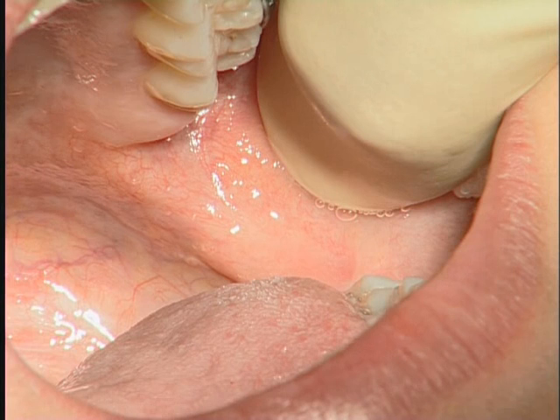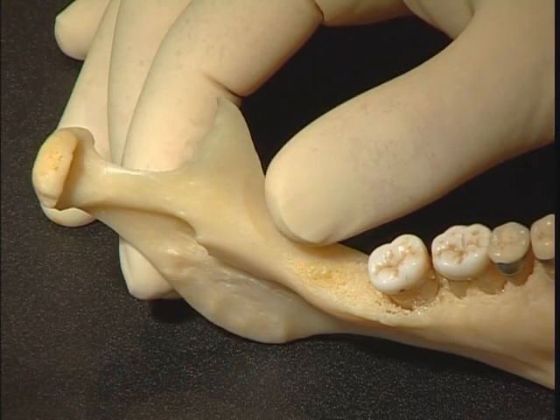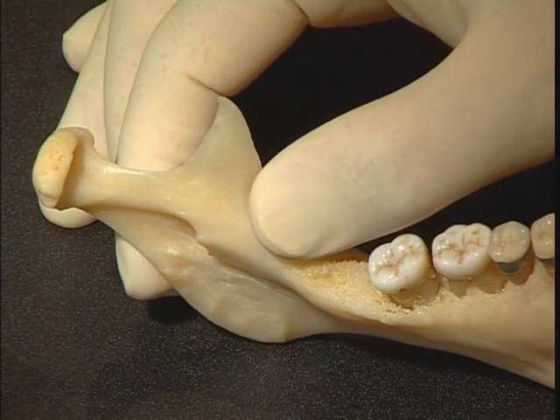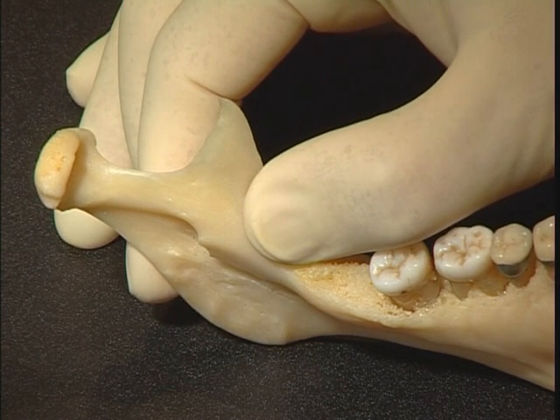Wedge the end of your thumb into the deepest part of the anterior edge of the lower jaw and assess the distance between the pterygomandibular ligament and the anterior edge. The point of penetration is usually a third of the way from the ligament and therefore outside this. By sliding the thumb medially and placing the base of the nail on the anterior edge, you will feel the reach of the deep tendon.